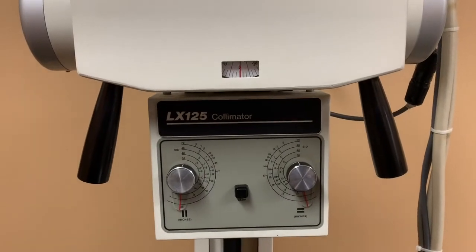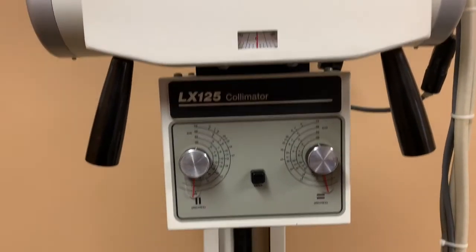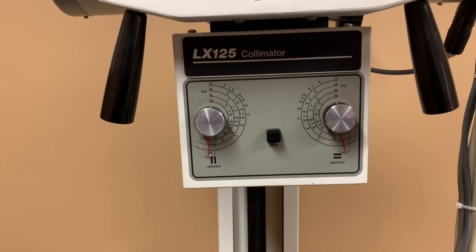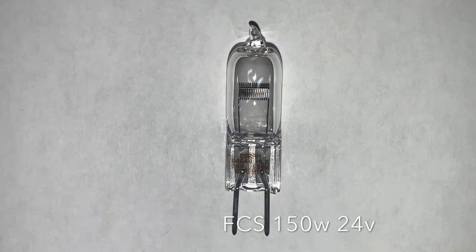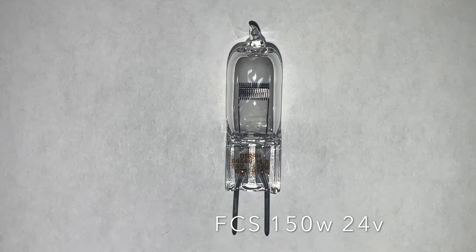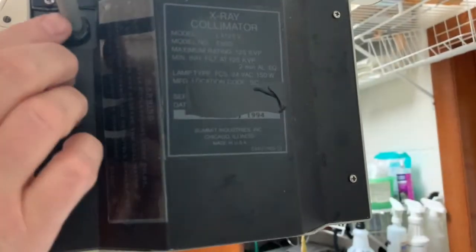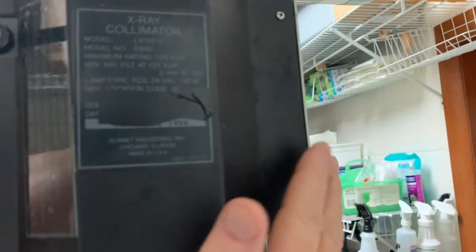This is an LX-125 collimator. It uses a 150 watt 24 volt FCS bulb. To access the bulb, you remove the cover by removing the screws on each corner.